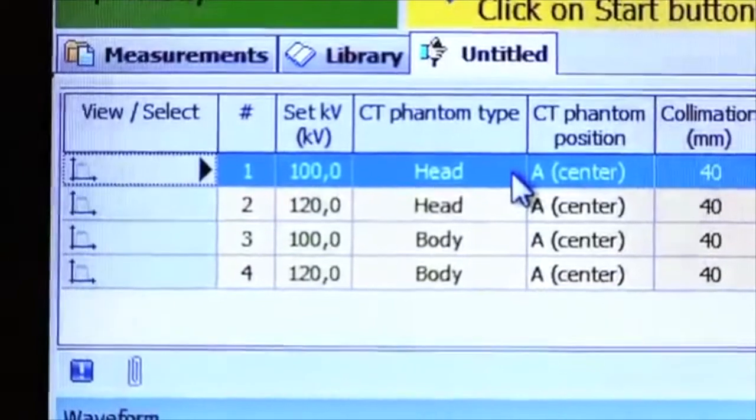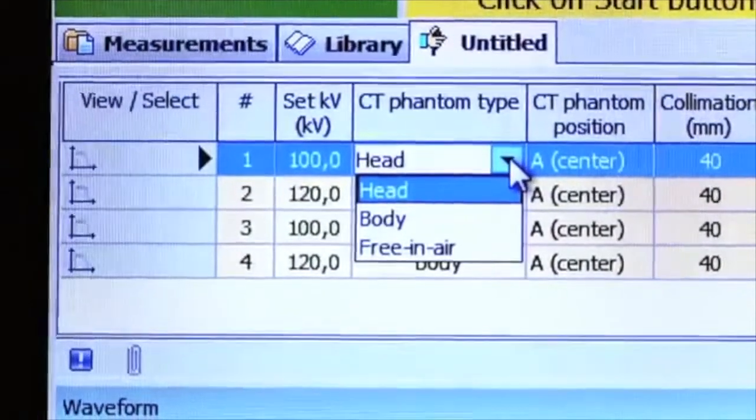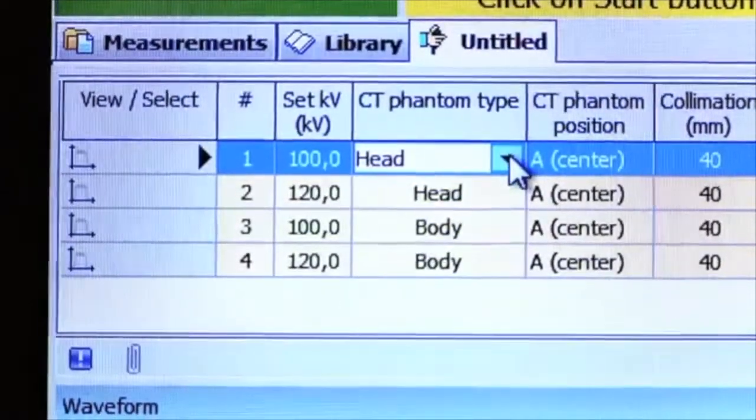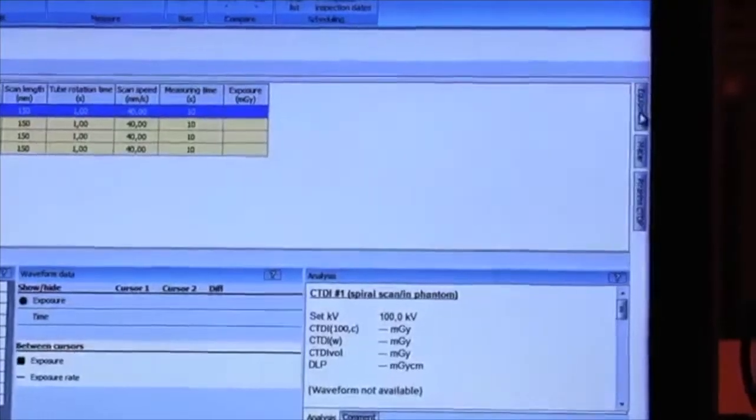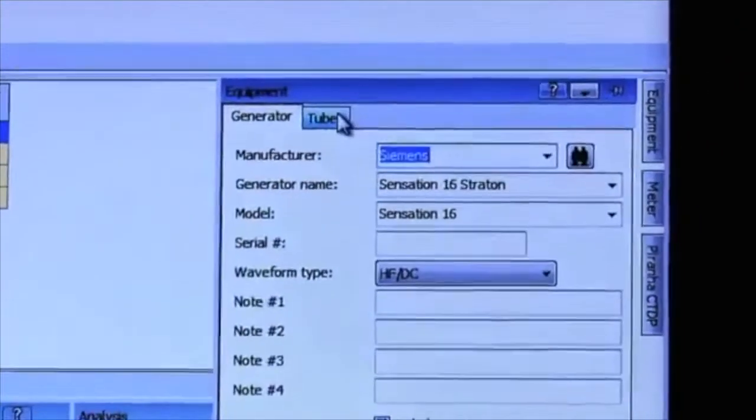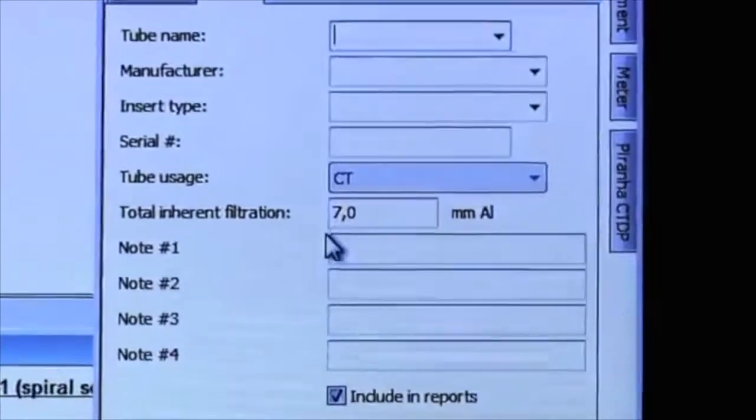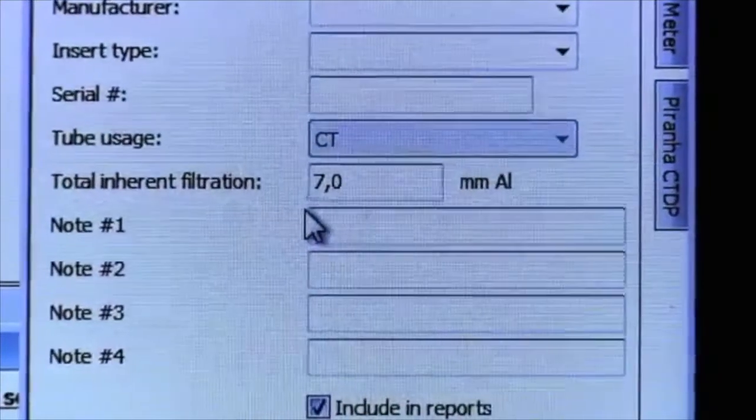You must also select the correct measuring mode. In this case, a measurement in a head phantom. If you know the total inherent filtration, you can add that too, or you can use the default value of 7 mm of aluminum.